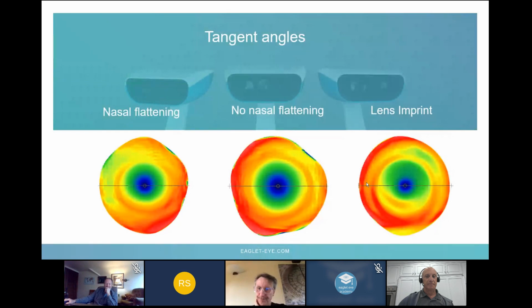How long do you need to wait until you can start refitting? It really depends on too much, actually. It depends, was it a very bad fit or was it just so-so? Was it a very large lens or a very small one? Because smaller lenses tend to settle a little more. So at that point, I always recommend, if it is possible, to take at least 2 days off. Yeah, you have to negotiate with your patient if that's really possible.